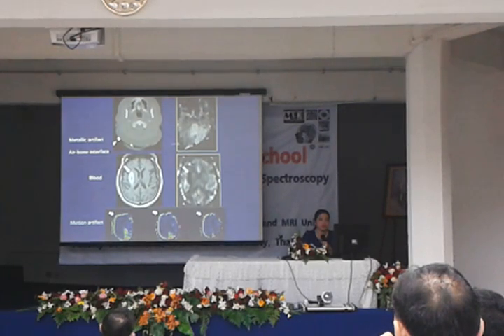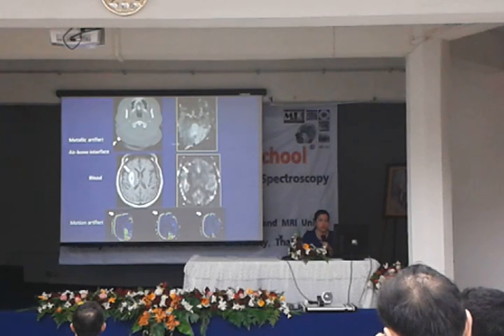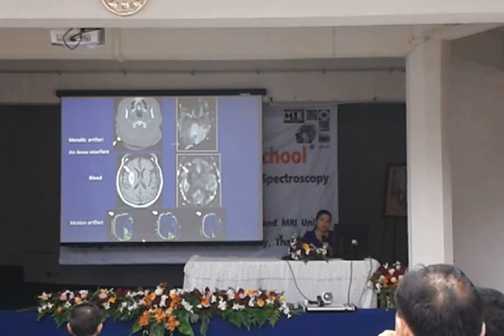And the problem in ASL is also that it's very sensitive to metal. When the patient has a metallic artifact, there is distortion in the image, or blood product can distort the quality of the image a lot. Or even how to get the image by subtraction technique. If the patient moves a little bit, the image becomes very blurred and has artifact. And we didn't use it much.